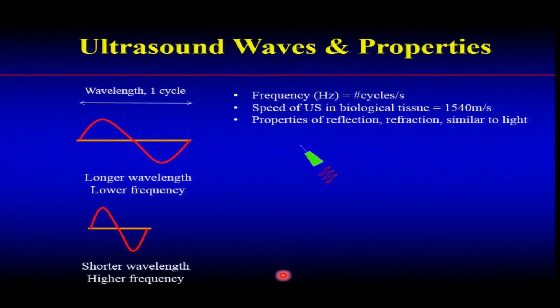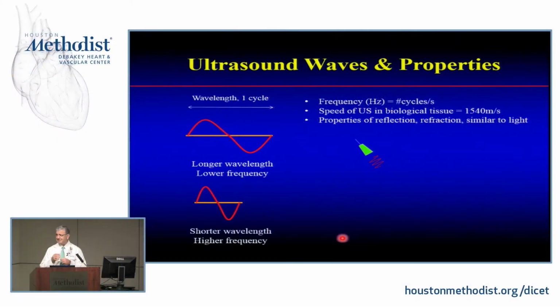So you like to have a little change. So this little animation, you have a transducer. And what's in a transducer? I know you don't usually open what's inside the transducer, but it has all these piezoelectric crystals that are, I mean, it's a science by itself.